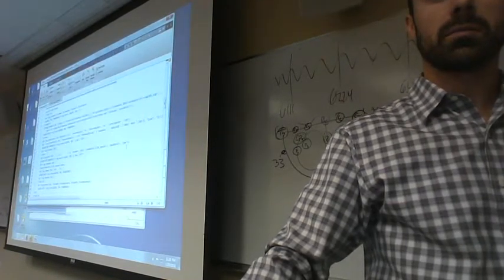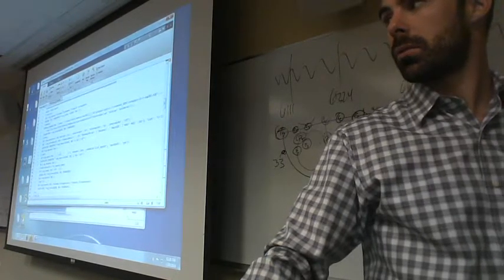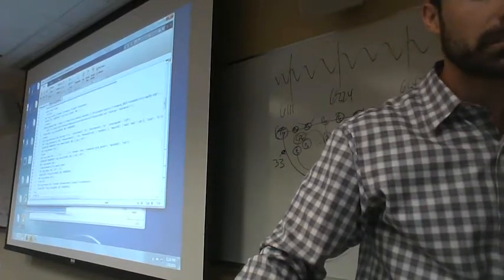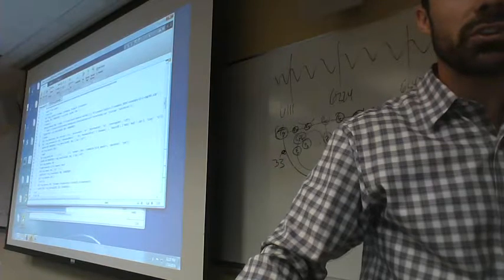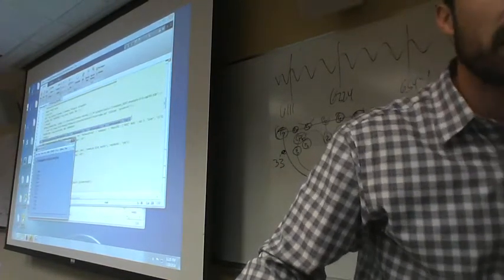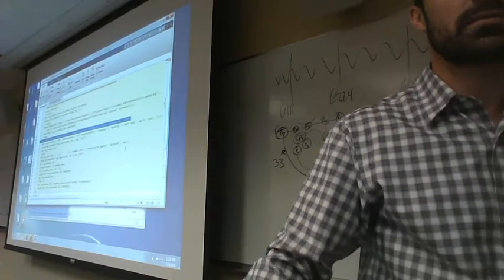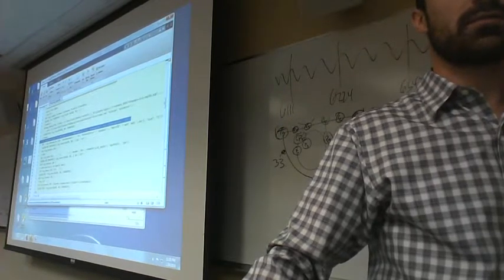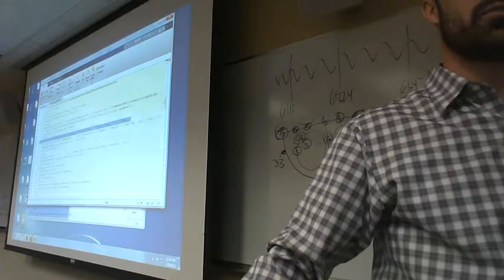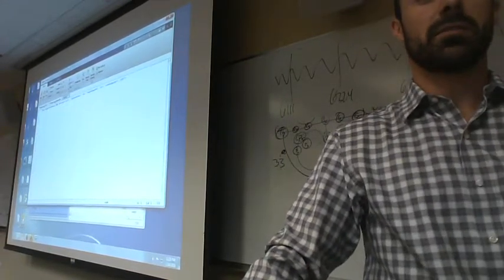After you select data using events and this other window comes up, just cancel out. I was just showing you something. So what you're going to do is open that script and copy line number 86, all the way in 86. You're going to create a new one here, paste that in, and we're going to uncomment it.